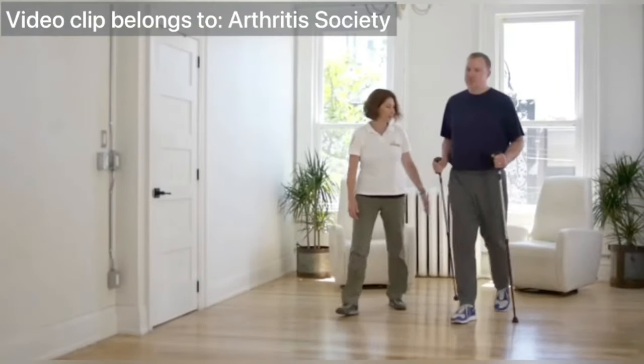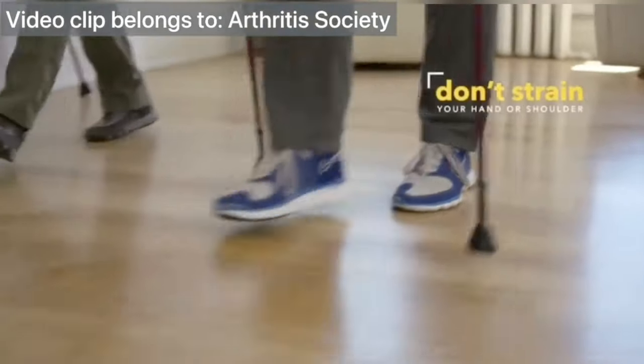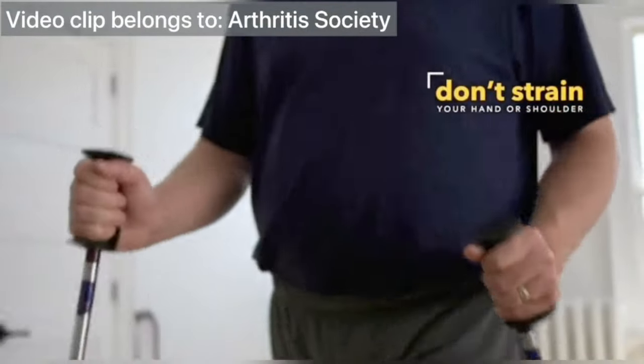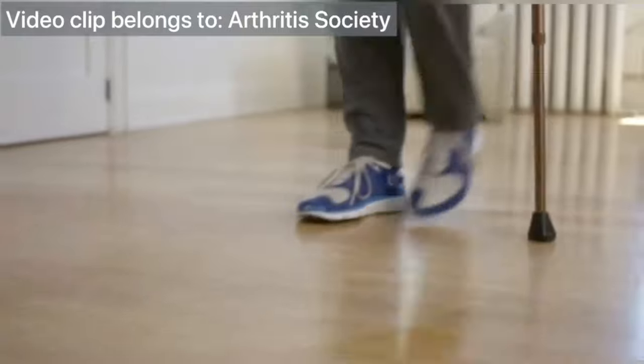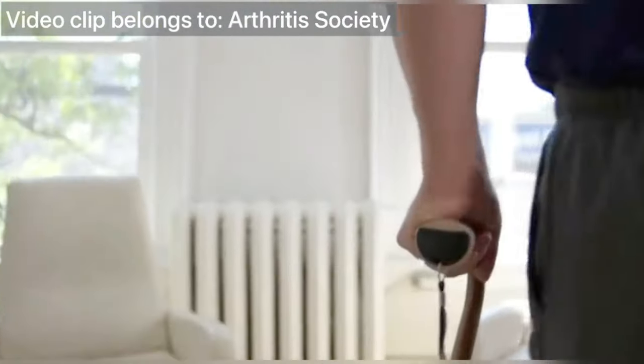We then proceed to evaluation of patient learning, which is important to verify patient understanding of the instructions. We must promote active patient participation. We can do gait training with and without orthosis while maintaining close supervision and progressing from double limb support to single limb support, and from stable to unstable surfaces. We can also ask our patient to demonstrate proper donning and doffing, skin inspection, and proper orthotic care and maintenance to assess the extent of what he learned.